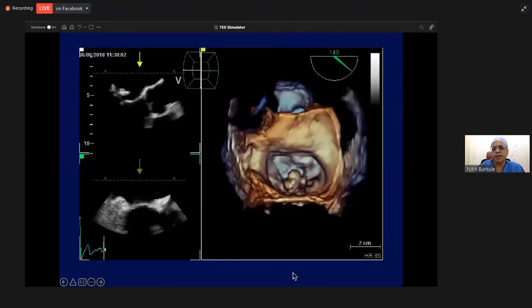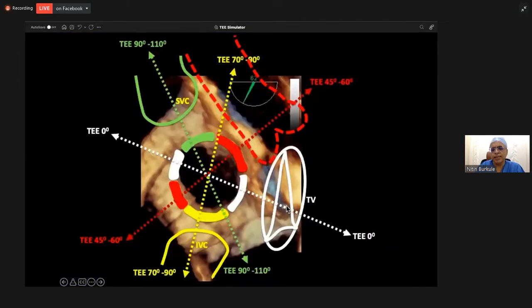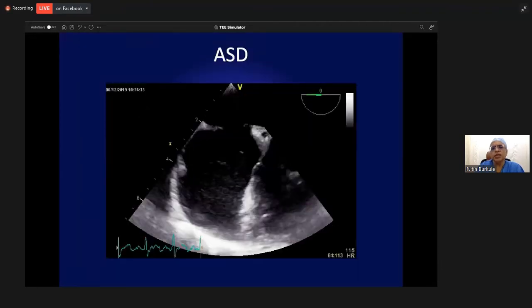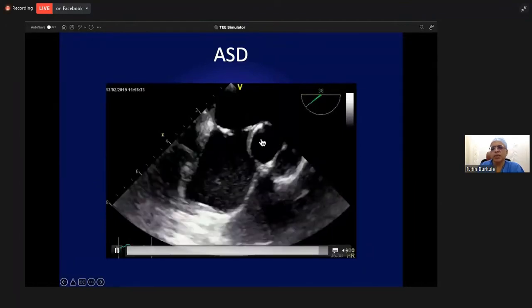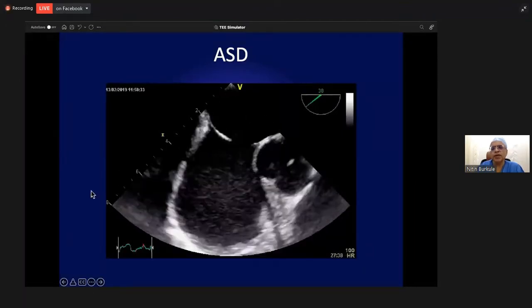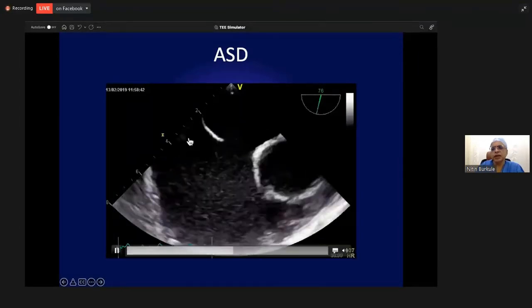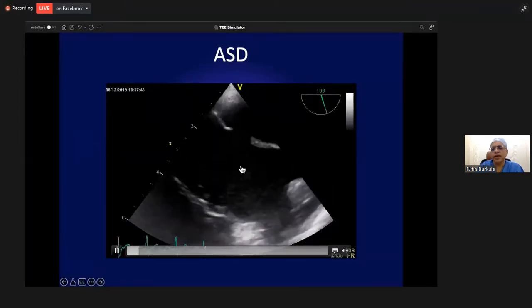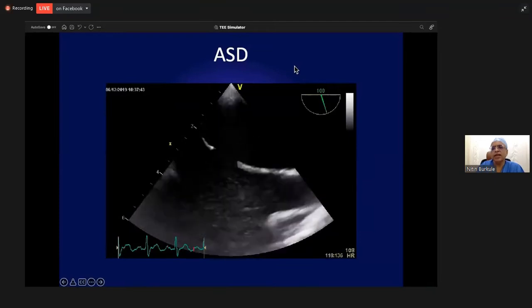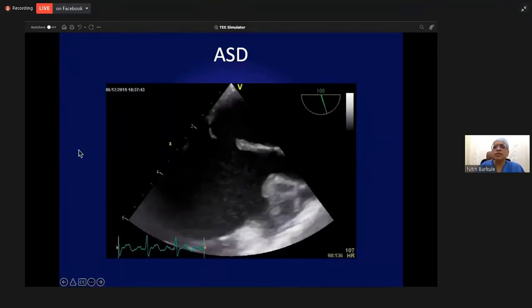The ASD assessment is a very routine part of transesophageal echo. These are the planes which you can utilize to see all the borders of the ASD for the suitability of device closure. This is a 0-degree view, and you can see the mitral valve margin here and the posterior superior atrial margin. This is the short axis view where you see the retroaortic margin and the posterior inferior atrial margin. At 70 to 80 degrees, you see the IVC side of the margin. Then you go to 110 and you see the superior vena cava side of the margin. That tells you when it is more than 5 millimeters, this is very suitable for a regular device closure.